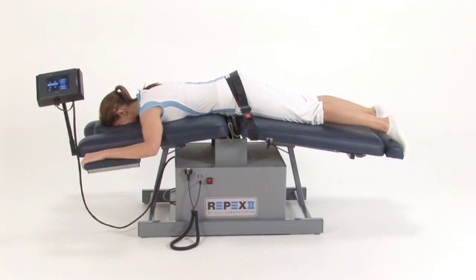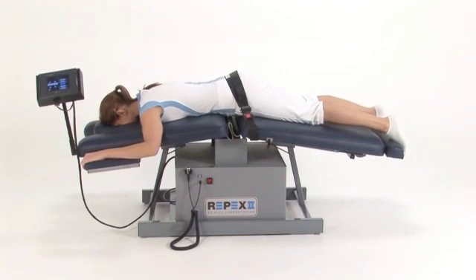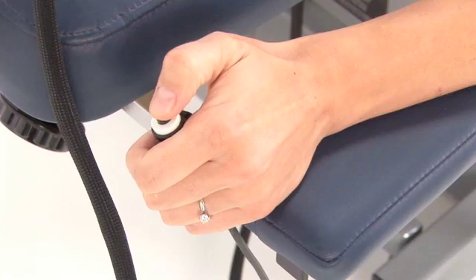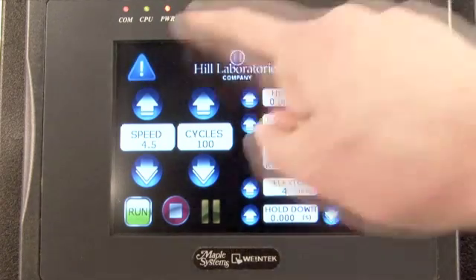Individual adjustments to the settings may be entered during the treatment at any time. If the patient experiences discomfort, they can use the emergency cut-off switch. The table will then stop the treatment and return to a horizontal position.